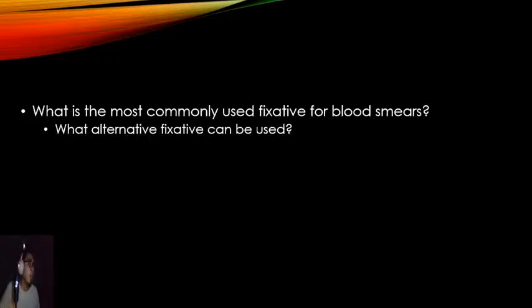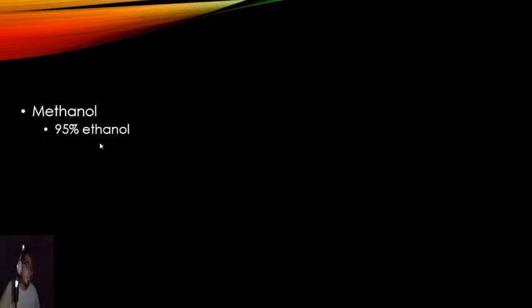That's the reason why I love the Leishman stain. It's very easy to use. The most common fixative for blood smears is methanol, as I've said earlier. But an alternative fixative could be 95% ethanol, of course. All right. Now, since we're talking about methanol, what is the problem?